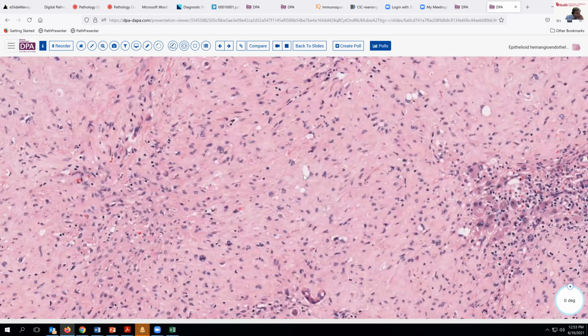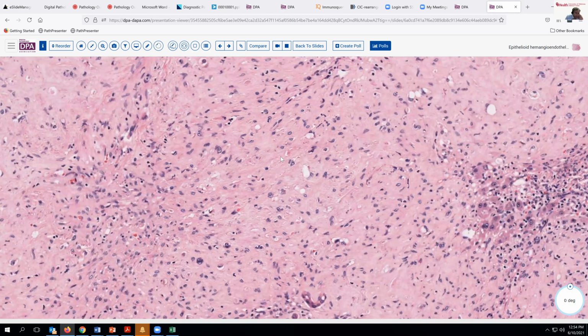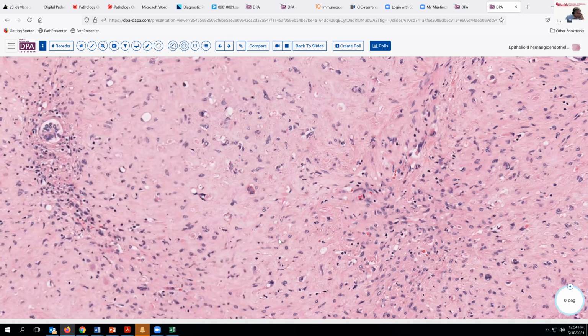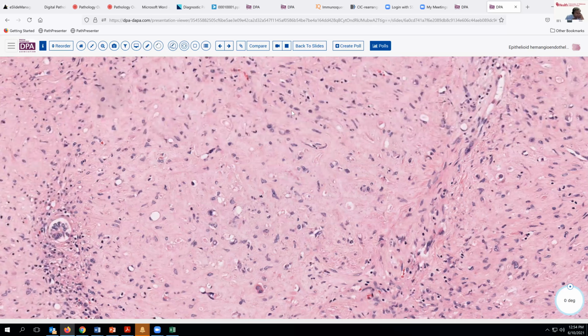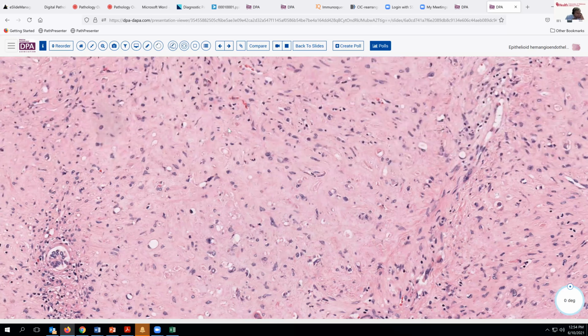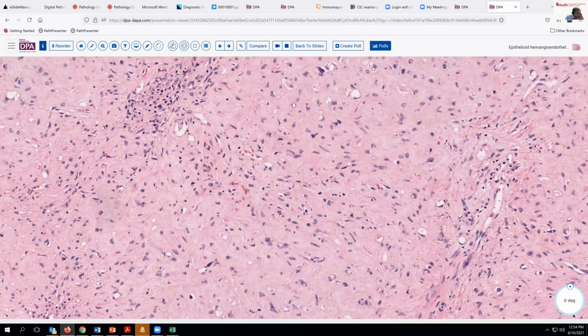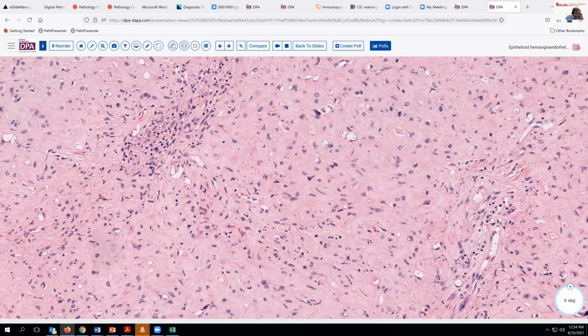So how does this turn into epithelioid hemangioendothelioma? Well, there are a few epithelioid cells in here, and you just sort of have to realize that this is one of the appearances of that morphologic lesion. So here's an example, lumen-like spaces and somewhat epithelioid cells with a lot of surrounding spindle-shaped stroma and sclerosis.